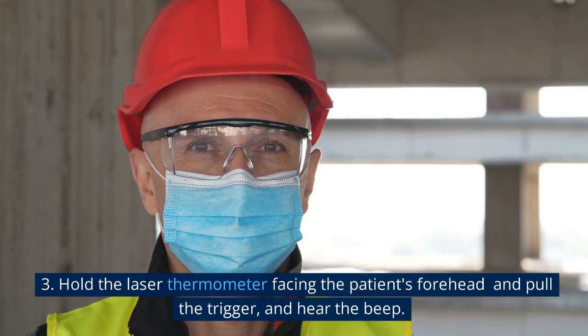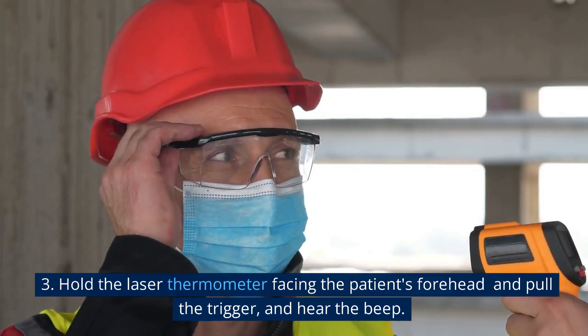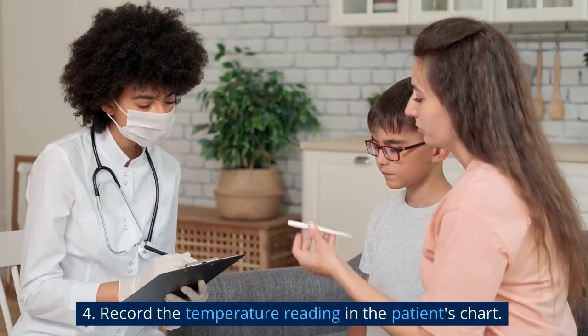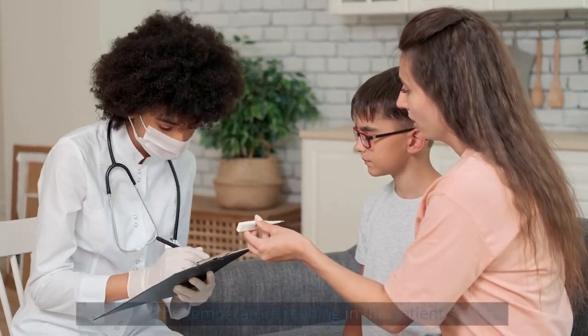Step 3: Hold the laser thermometer facing the patient's forehead and pull the trigger, and hear the beep. Step 4: Record the temperature reading in the patient's chart.